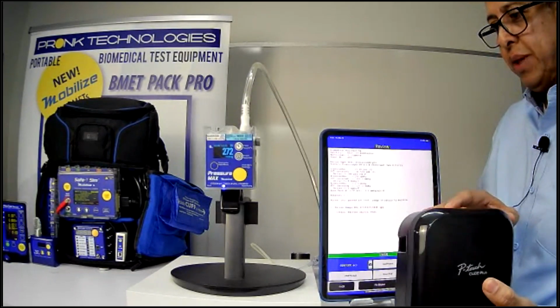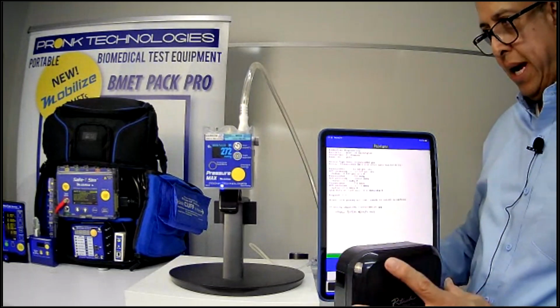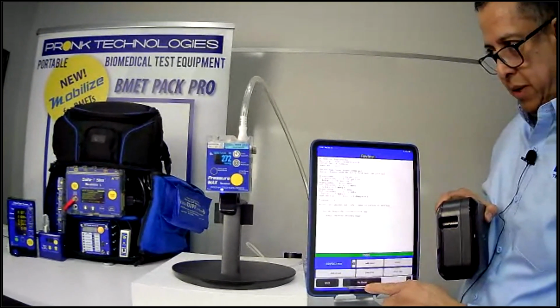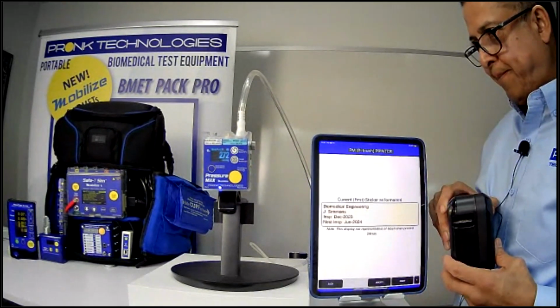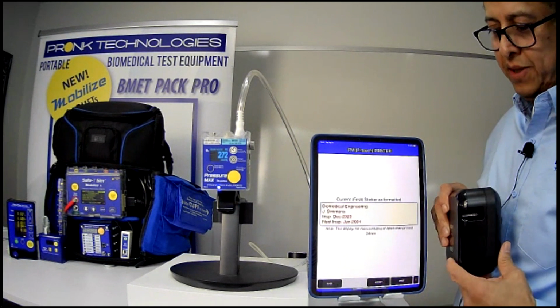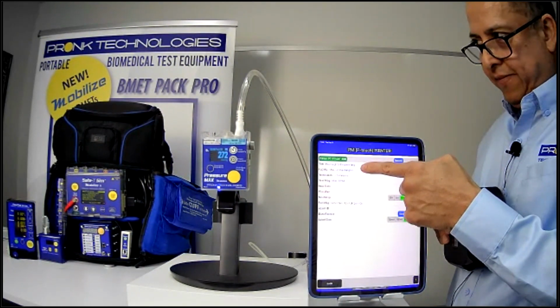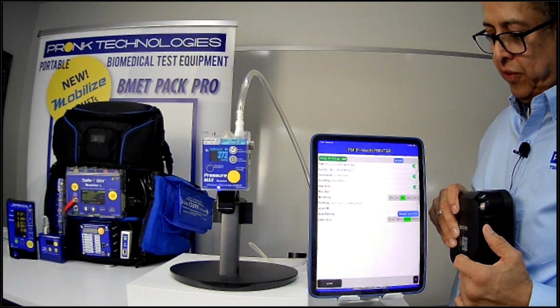So we work with this company to incorporate a driver to communicate to our app with. You can actually go to PM sticker here at the bottom. You'll be able to see a sample of a PM sticker you could possibly print. Or if I needed to modify it, I can go here and modify any of these fields that I want to have the information that I want on those fields.